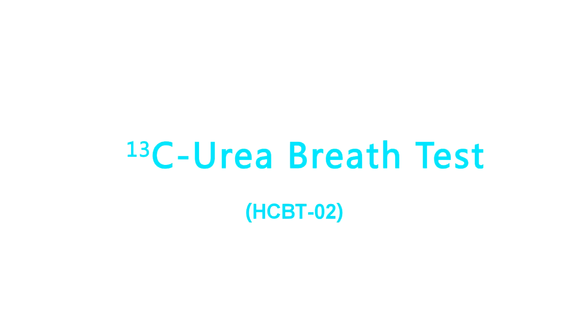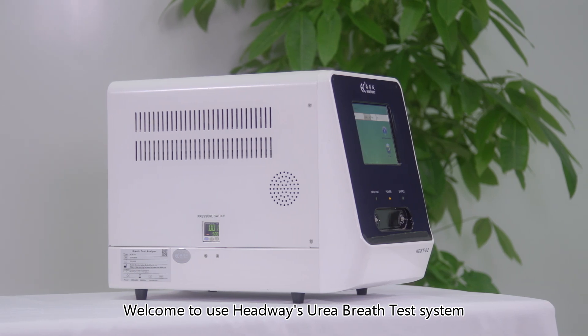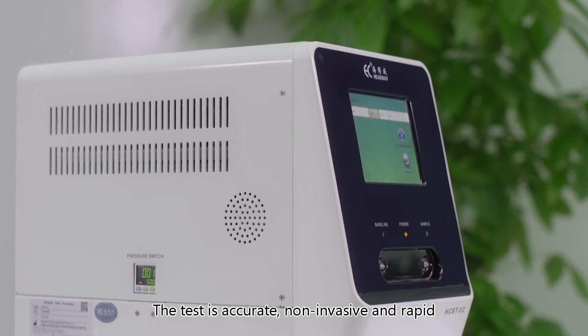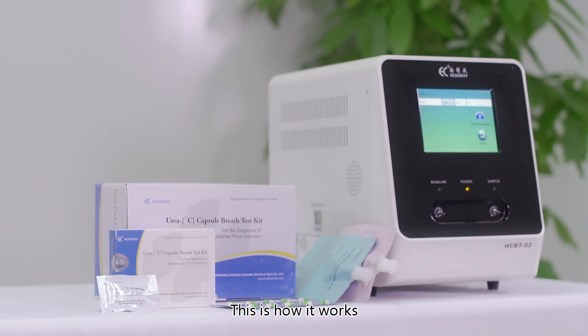Carbon-13 urea breath test. Welcome to Headway's urea breath test system, which is an advanced diagnostic tool to detect Helicobacter pylori. The test is accurate, non-invasive, and rapid. This is how it works.